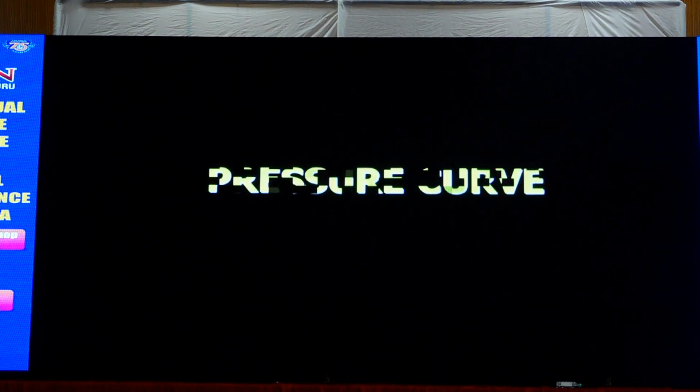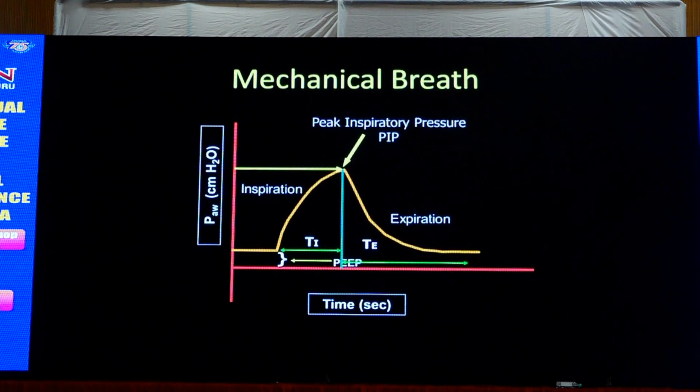The next 4-5 slides are very important. That is where lung protective ventilation comes into play. If you want to learn scalars, those are the 4 slides of scalars you should remember to produce lung protective ventilation, even in anesthesia, in critical care or in ICU practice. So when we come to pressure versus time, this has to be pressure, it can't be flow. So this is the peak inspiratory pressure. And the base pressure that is already there is called the PEEP.